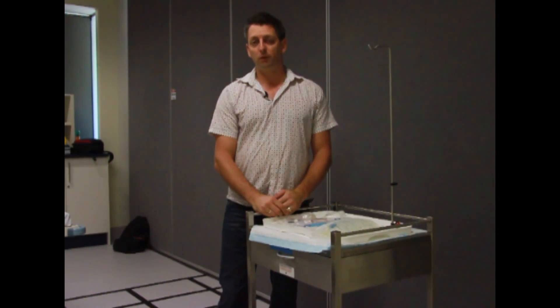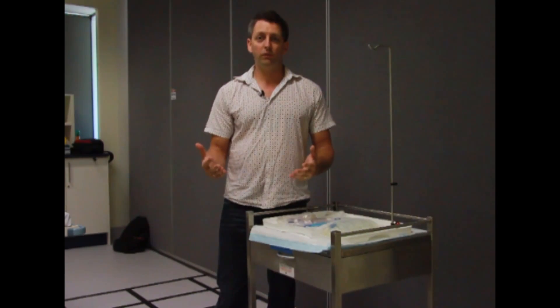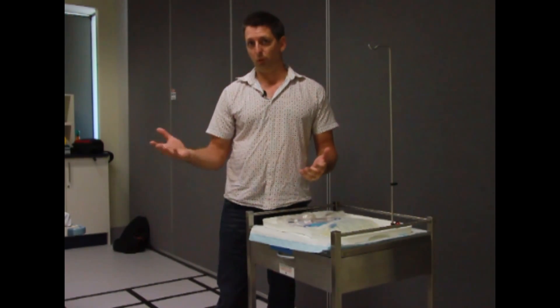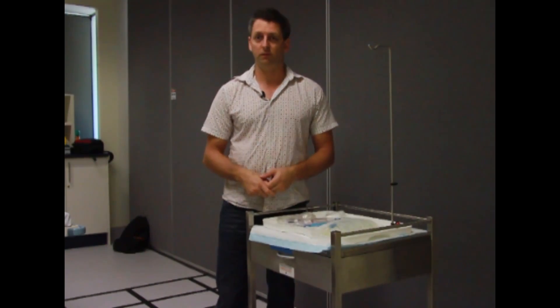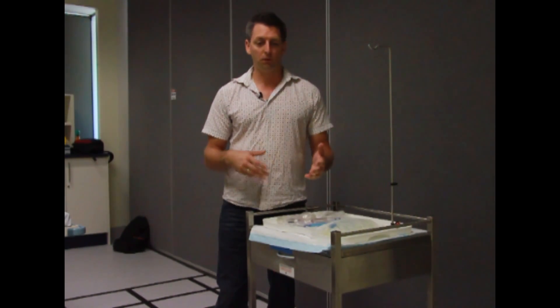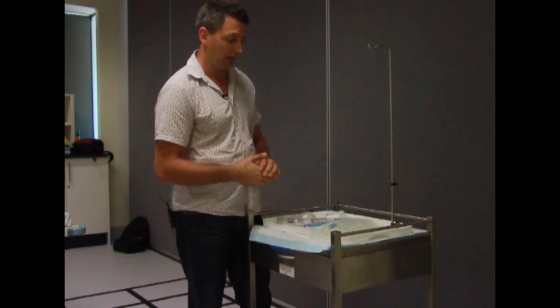First of all, we want to explain to the patient why we're giving them IV fluids, and you've got to know yourself as a nurse why the doctor has prescribed the IV fluids — that's very important. Also check the order, make sure the name, date of birth, and the order match the patient, and then get your equipment out.